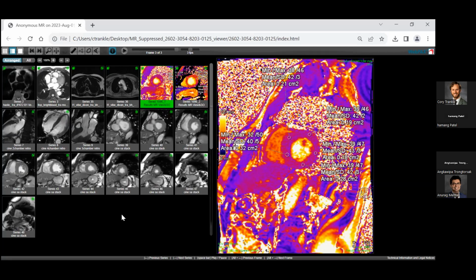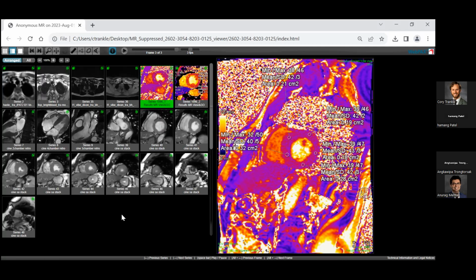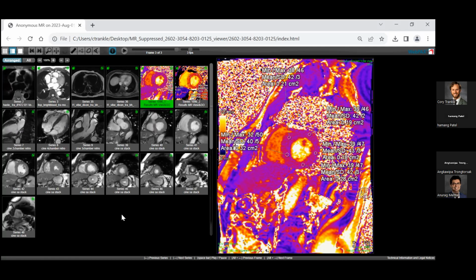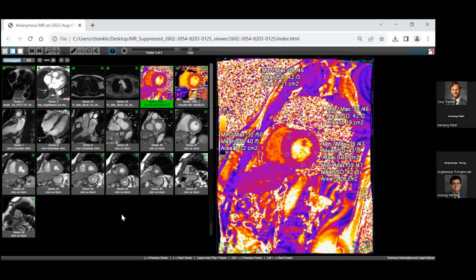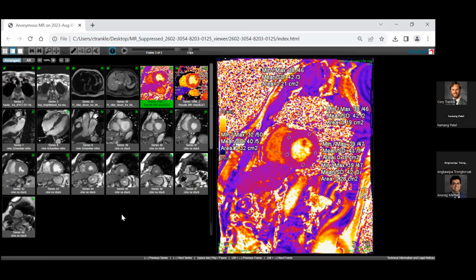We're not going to take the time to do color for all these other images in the top left of the monitor because we don't need that. But for T1 times and T2 times, as part of that proton thing and the FM radio waves and all that, we're going to need more dynamic range. And so that's why they are in color.